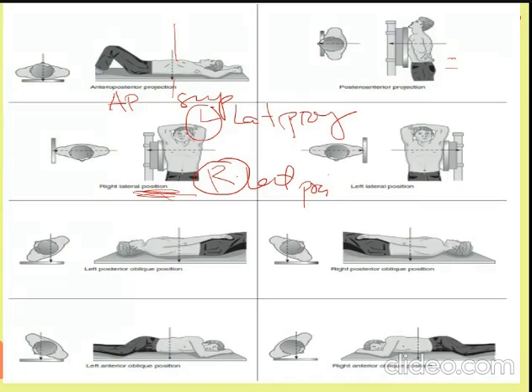What kind of position is this? Left lateral position. How about projection? Right lateral projection. Very good.